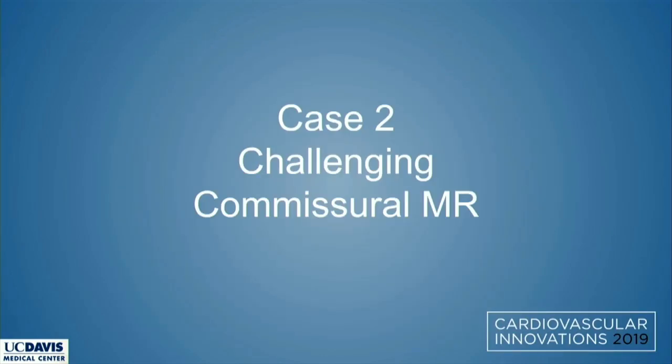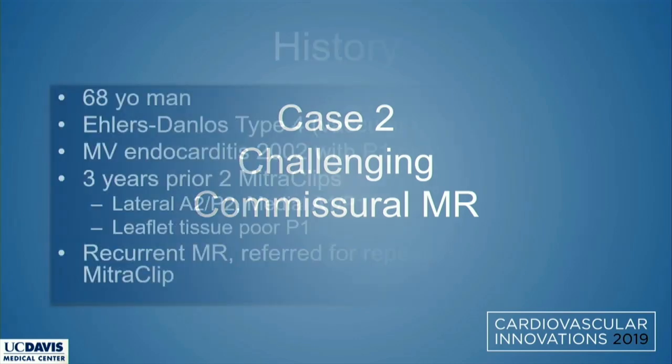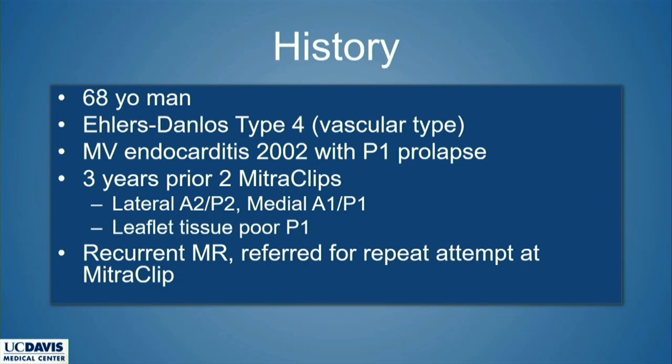So these small intraclip leaks are successfully treated. When you start heading to the commissures, it can be a little bit more challenging. And this is a case that we struggled with quite a bit, but I thought I'd show it to you. Taking a note from Samir Ghafoor, you learn from your mistakes and your failures, and this is one such case. So this is a 68-year-old male.